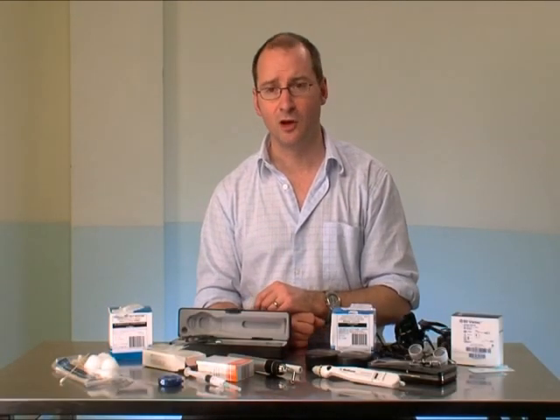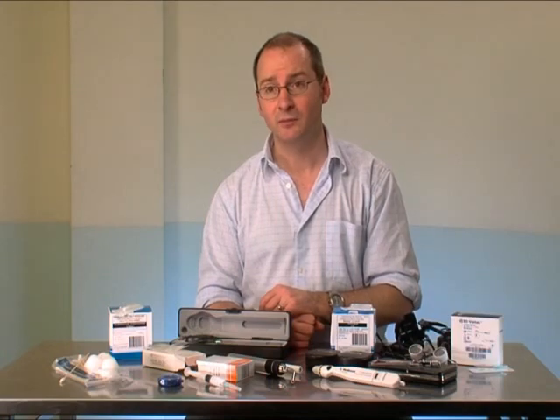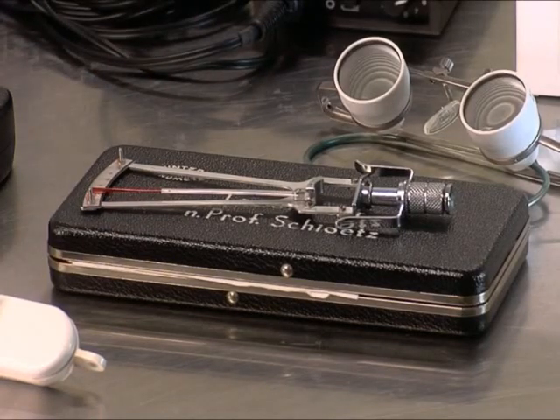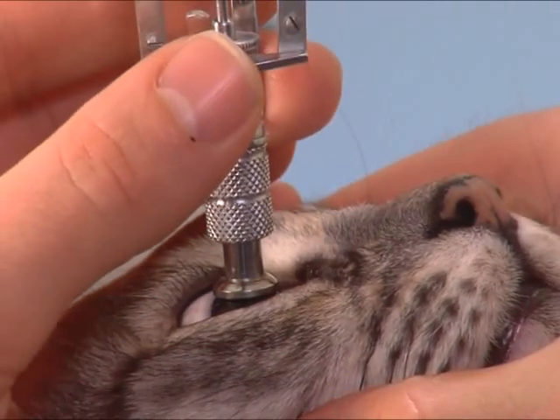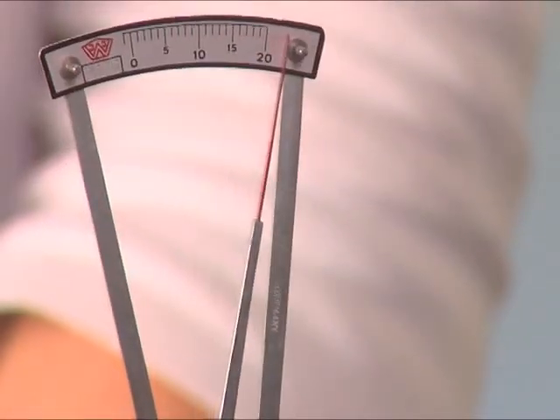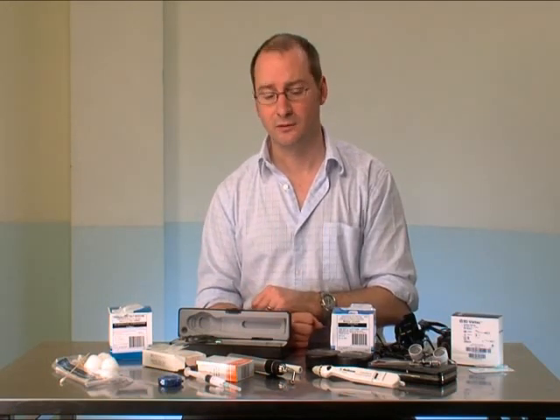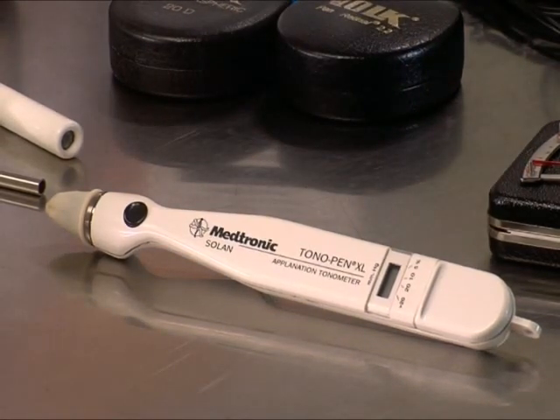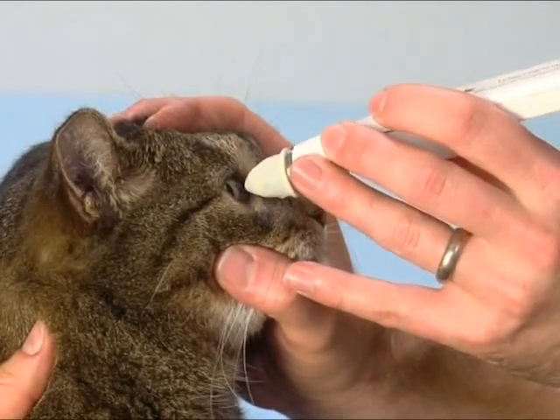Further ancillary tests, again, if you've got pain or concern of vision or abnormalities with the globe itself, you might be concerned about pressure, and I think it's important to have some sort of means of measuring pressure. I recommend the Schiotz tonometer as a very good instrument for private practice because it is relatively cheap and affordable and will give you an all or nothing. It is not perhaps as precise as some of the other equipment available, but it will be able to tell you whether an eye is hard or whether an eye is soft compared to the contralateral eye. If you're feeling like spending more money or you've got a particular interest in ophthalmology, then something like the Tono-Pen is an excellent device for everyday use.